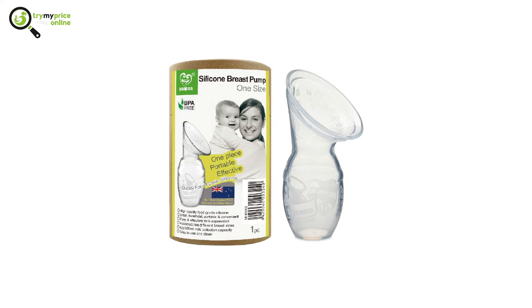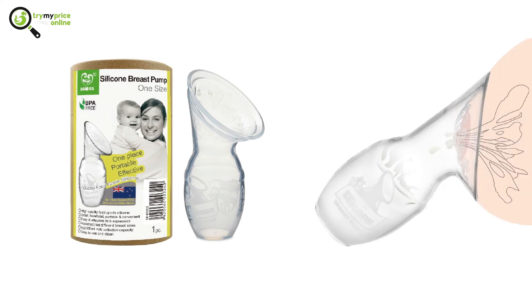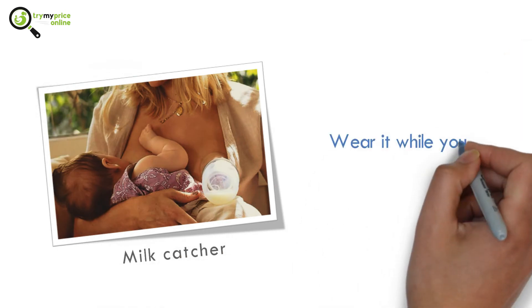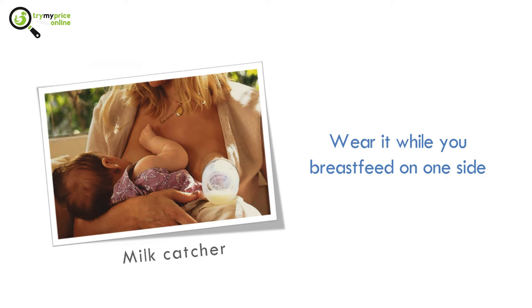Number 2: Haaka Silicone Breastfeeding Manual Breast Pump. It is a molded silicone pump that you use to express your breasts manually. This breast pump is best utilized as a milk catcher instead of a siphon — wear it while you breastfeed on one side and it will capture the letdown on the other side.